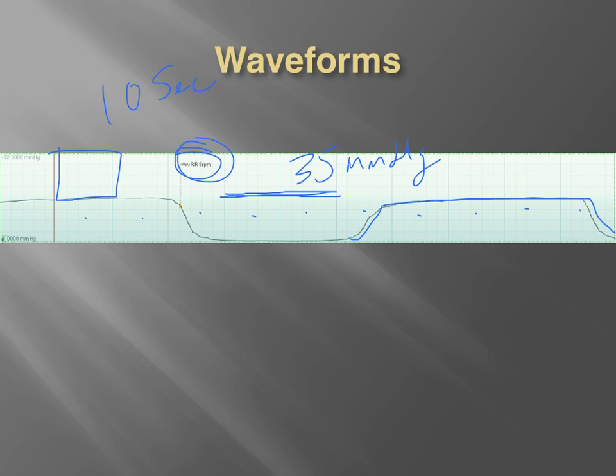breaths per minute. We have to remember that the respiratory rate that's being measured by your machine is a rolling calculation. So if someone stops breathing, but their respiratory rate was 35 to begin with, then the rolling rate is going to slowly decrease. It's important for us to recognize that, because we may actually have a waveform and then no ventilatory status at all.